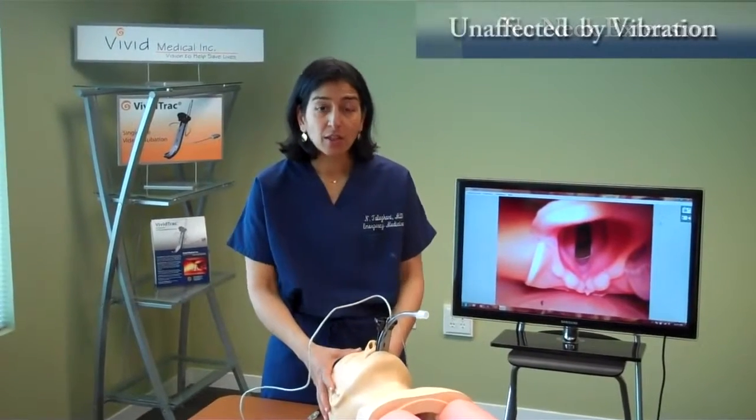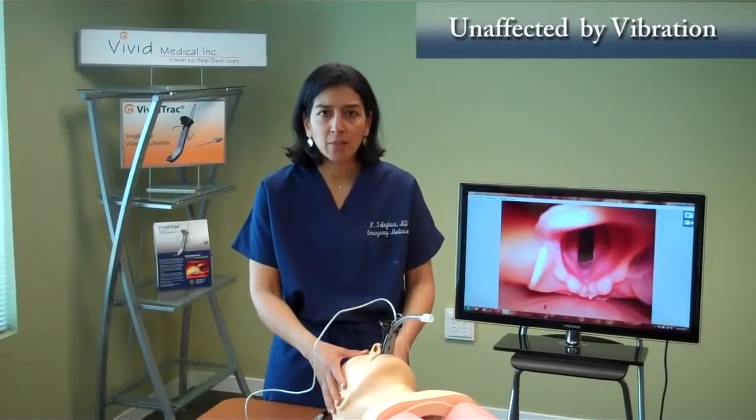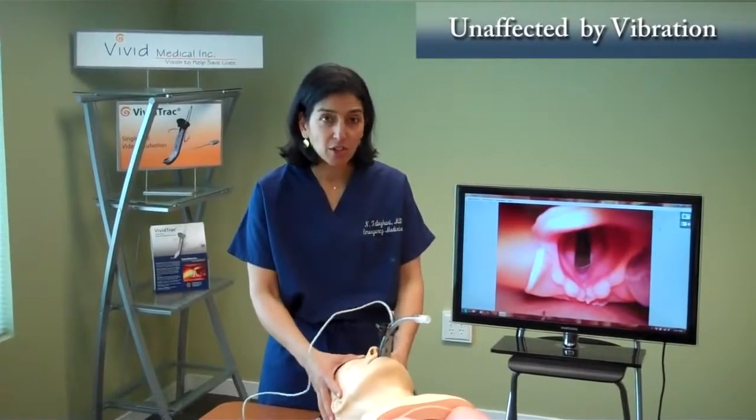Secondly, if there's a vibration or a movement as the patient's being intubated in a moving vehicle, for example, the vibration is not going to affect it.